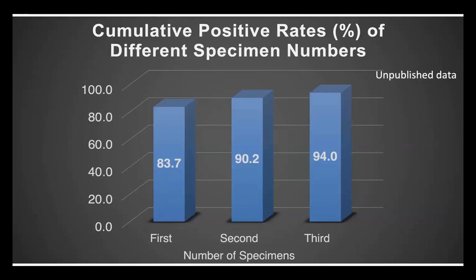We can see the cumulative positive rates increased rapidly from 83.7% for the first sample, to 90.2% after 2 samples, and 94% after 3 samples.